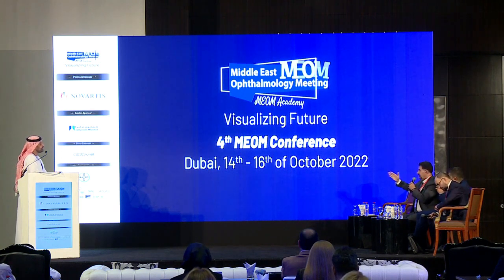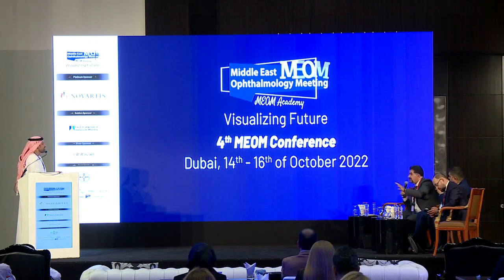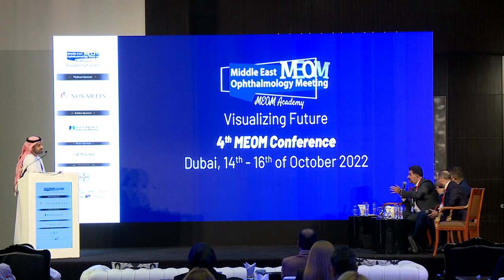Take the history, take the stage from when you did the cross-linking for the patient. So is it epithelium on or off? Off, for me. So at least the first 3 months for the epithelium to return to normal. So we are not going to rely on the Pentacam in the first 3 months.